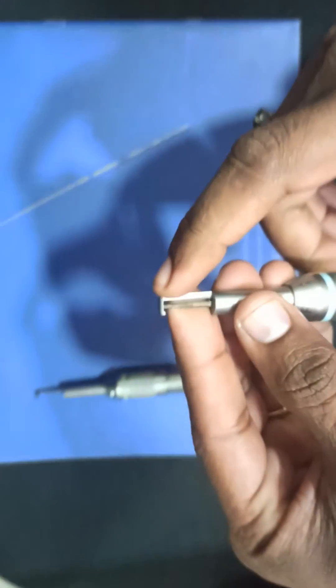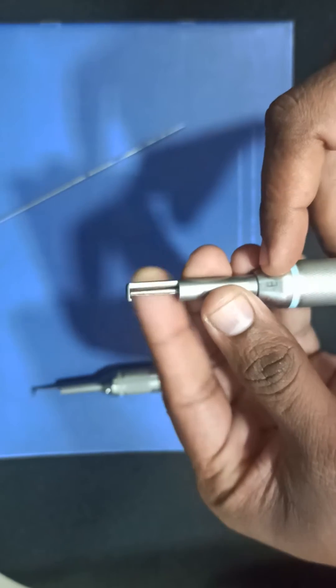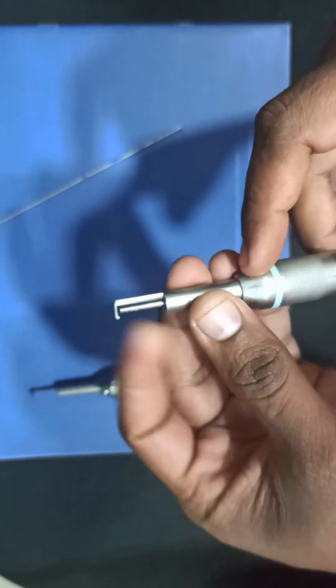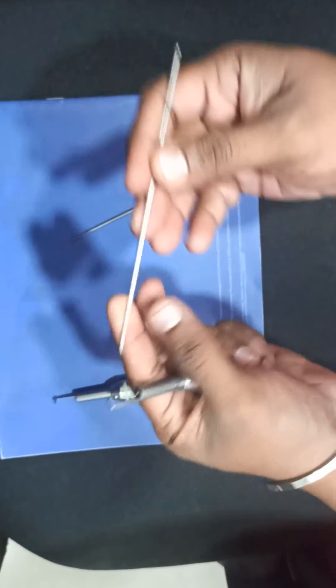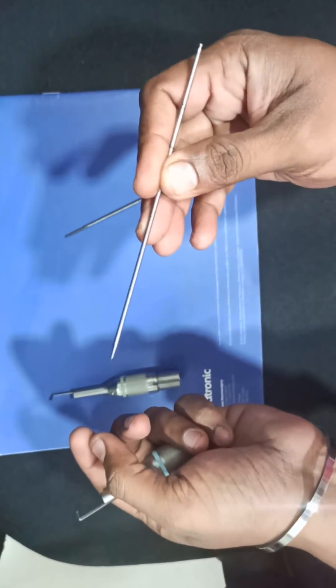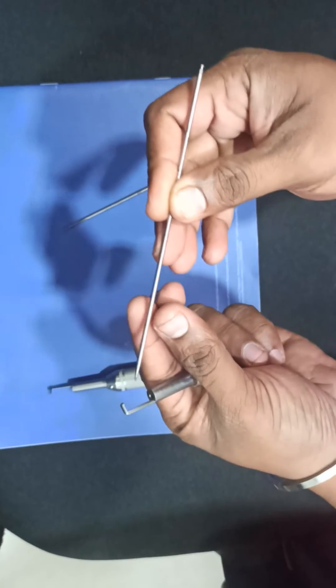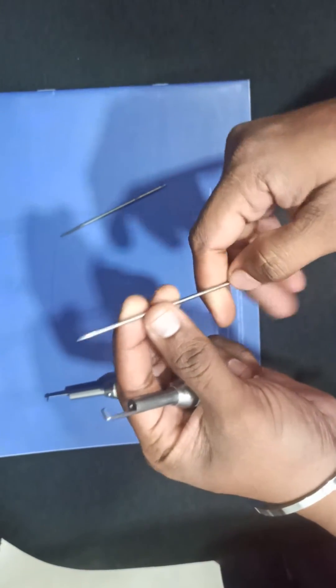Sometimes, for example, if you have a defective tool, how will you find it? For that, what you have to do is take one 10 or 15 centimeter tool. This is a 15 centimeter tool, or you can take any 10 or 12 centimeter tool.